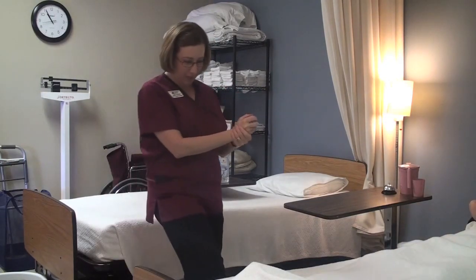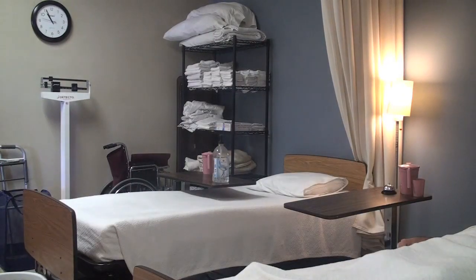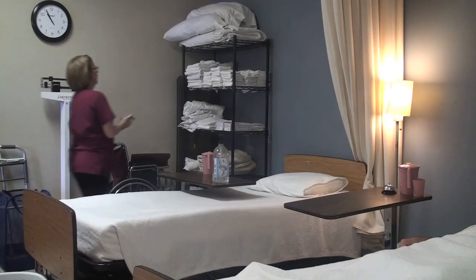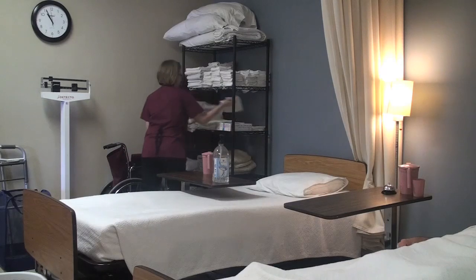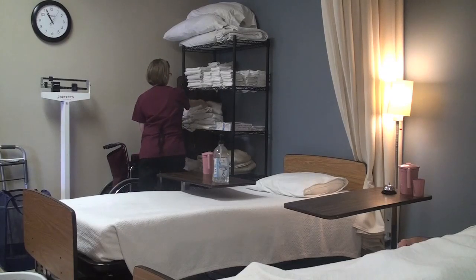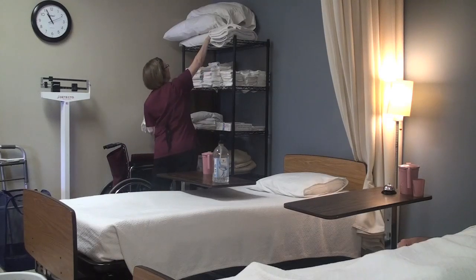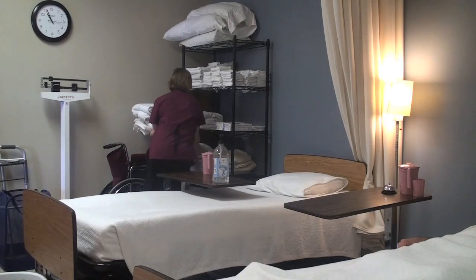I'm going to go ahead and check your bed brakes, make sure the bed doesn't roll away. I'm going to go ahead and get my supplies: I'll have a towel as a barrier for my table, a pillowcase, a flat sheet, a fitted sheet, a blanket, and a bath blanket.